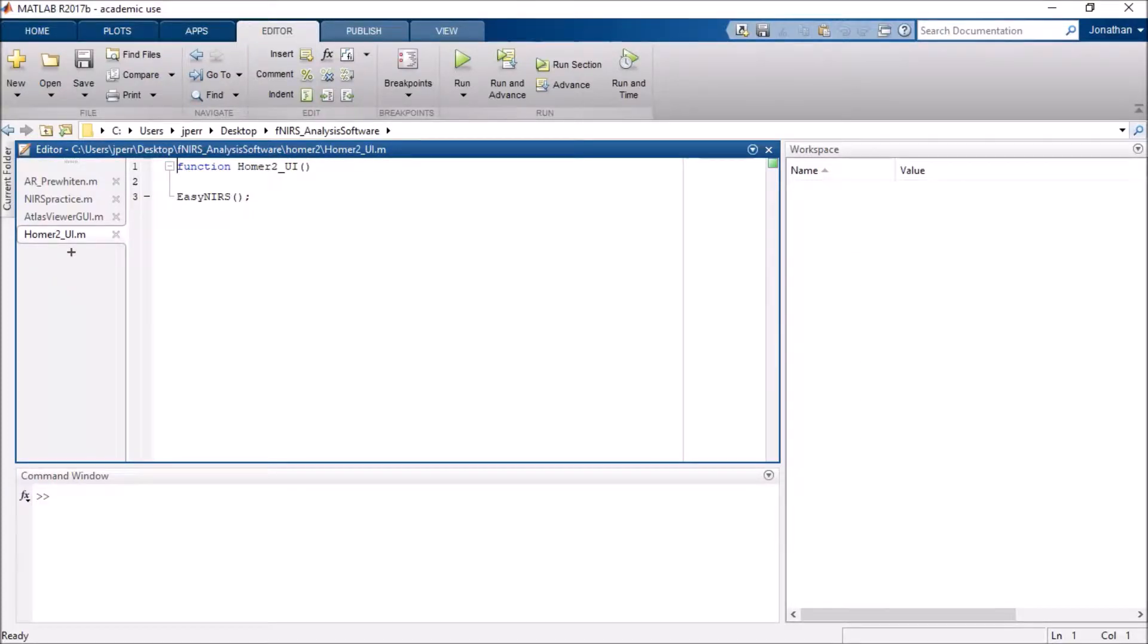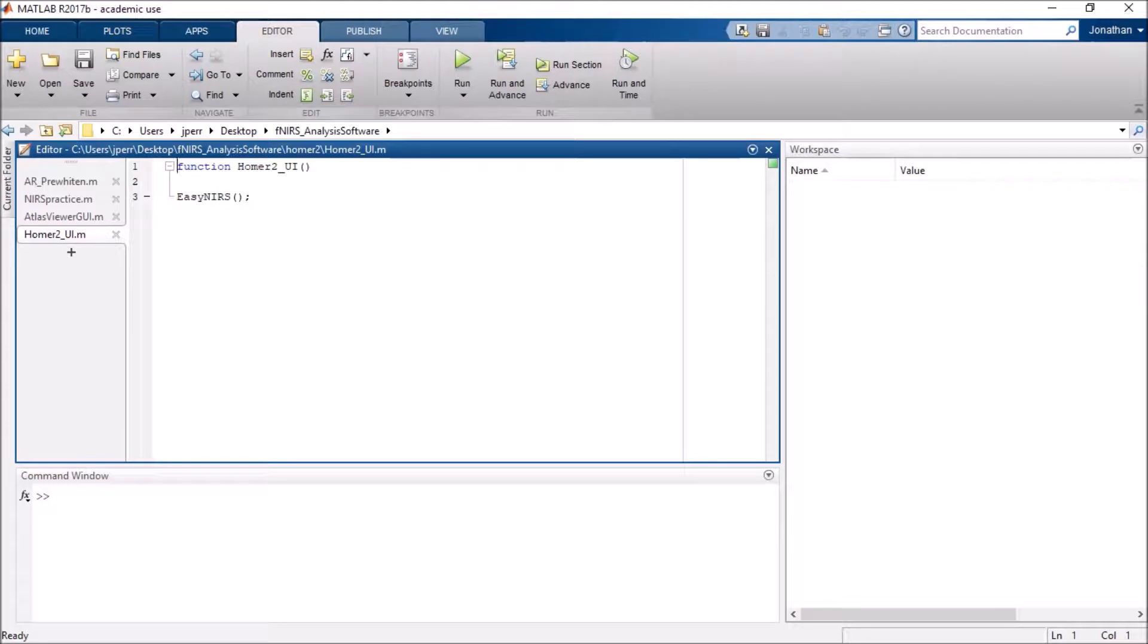Hello everybody. This is going to be a quick video about how to overlay concentration data into Atlas Viewer.